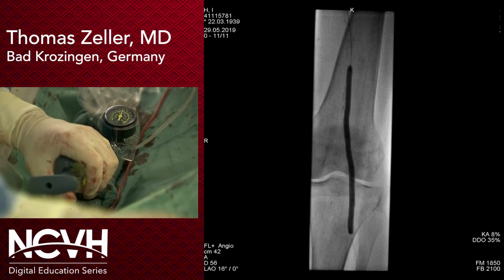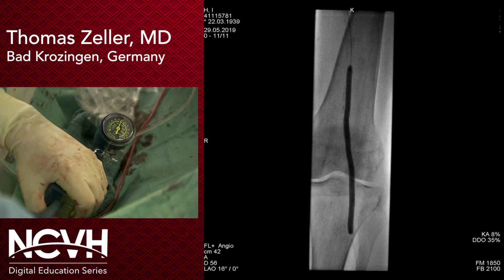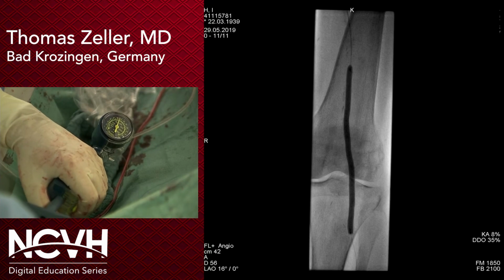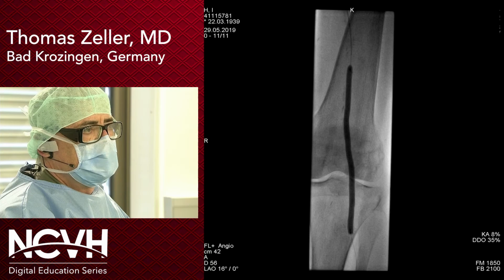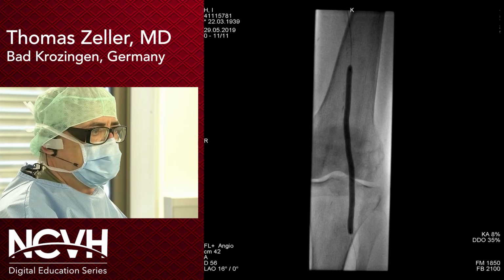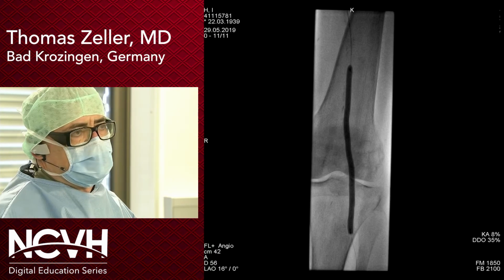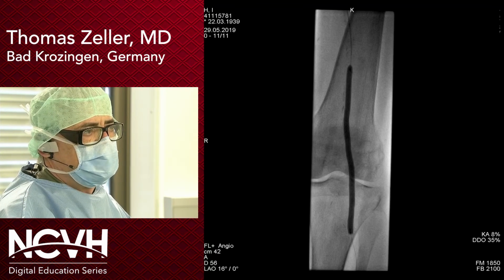So Greg had been talking about the correct technique of balloon angioplasty. We are following this very much, so we really inflate our balloons, and this is independent whether this is a drug-coated balloon or an uncoated balloon, for at least 3 minutes. Below the knee, we even use up to 5 minutes of inflation time, and we really have the impression that using this kind of balloon angioplasty strategy, we can improve the outcome.